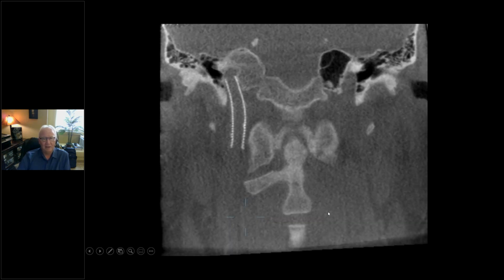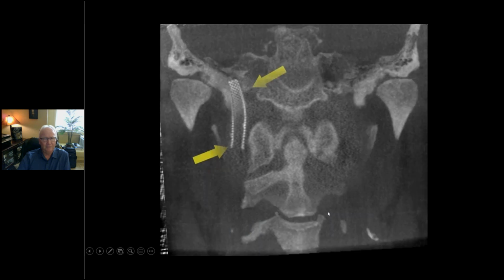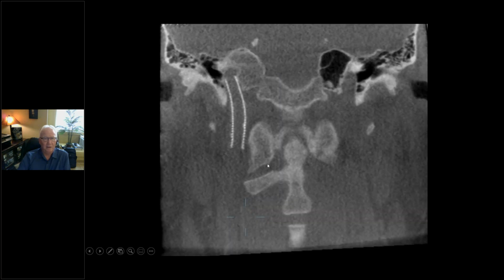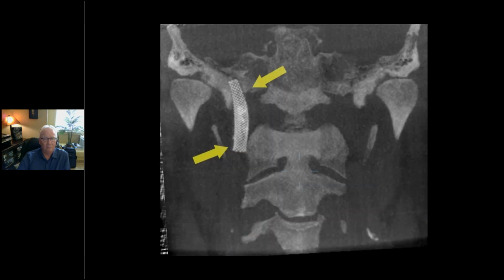Oh, I'm not going to see it. I don't have a big enough field of view. Yes, you do. There's the condyle. There's the stent. They already got their diagnosis. They had plaques. They got roto-rooted, and they got a stent put in, and they got more of it coming over here. I see calcifications here and here. I sound like the movie, don't I?